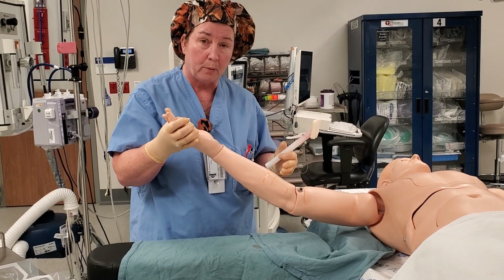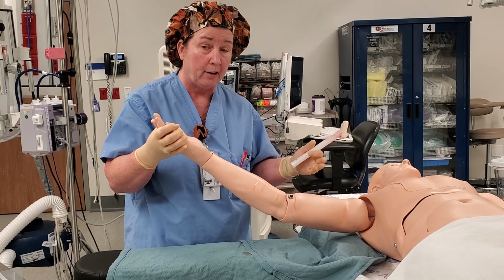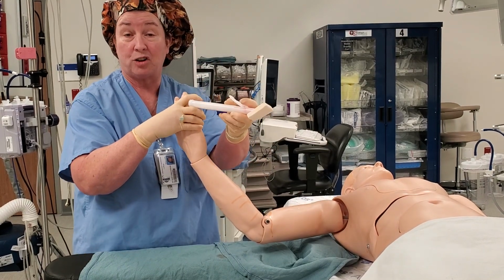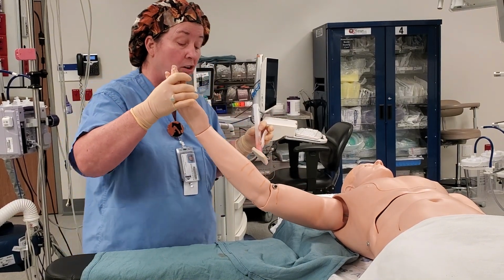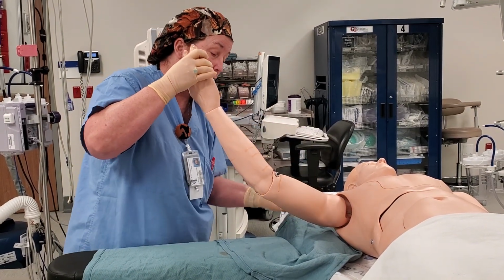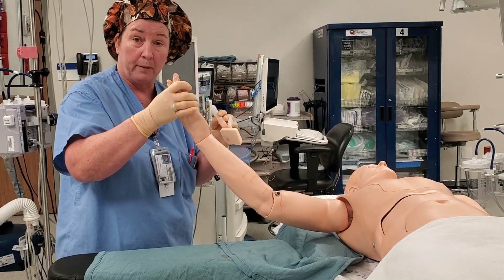It's always remembering that you're going to start at your incision site and you're going to work towards the periphery from clean area to dirty area. If I'm lucky enough to have an arm holder when I do this prep, then they would be holding the hand when I got started, and I would be able to, assuming this was someone else holding the arm, start at the ulnar nerve and work my way circumferentially all the way around the arm to the shoulder, making sure not to touch the axillary area. And then I could come down the arm.